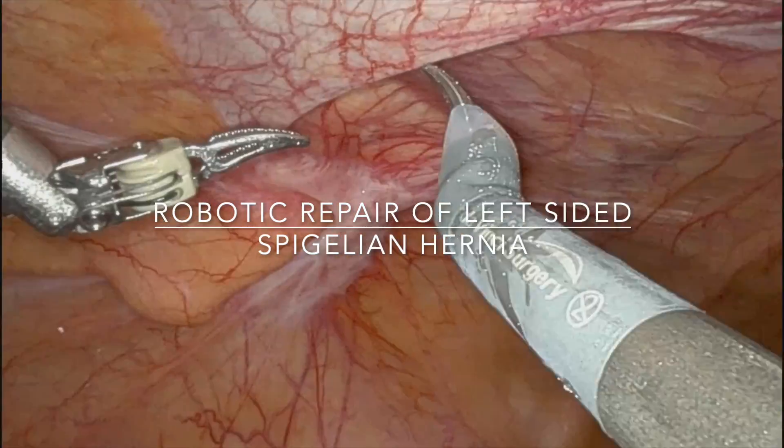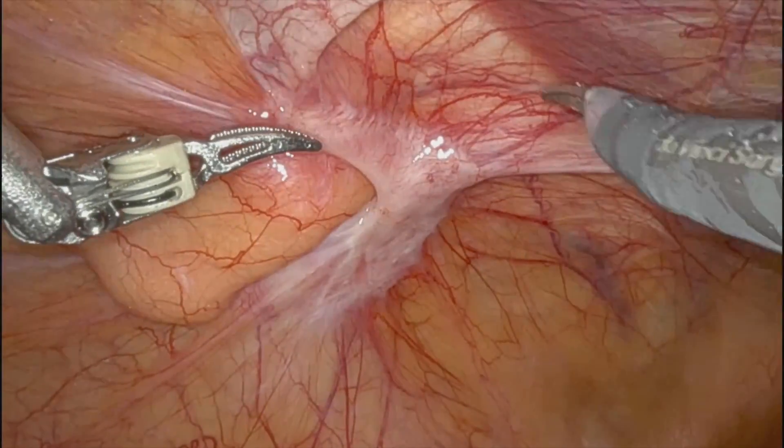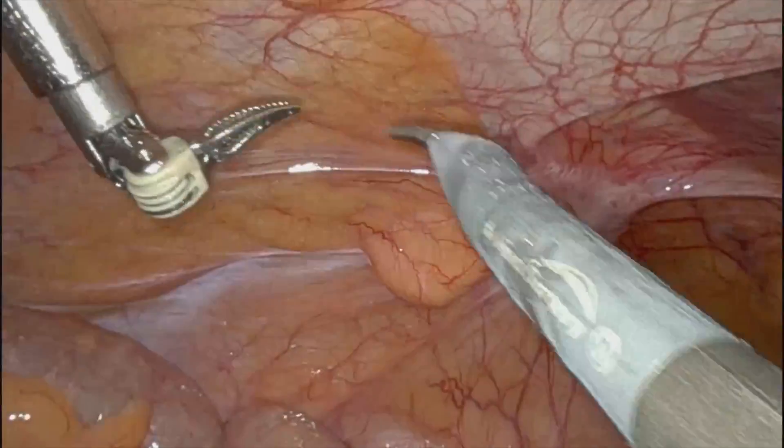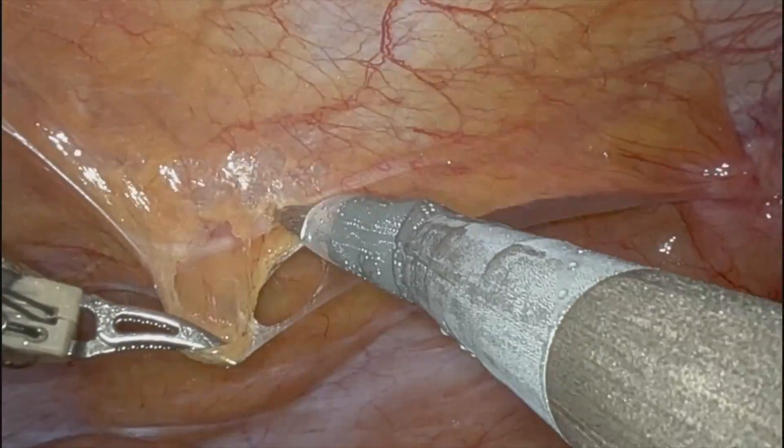This is a very active, healthy female who presented to my office in the elective outpatient setting with a spigelian hernia, as you can see there. Spigelian hernias — I treat them just like an inguinal.